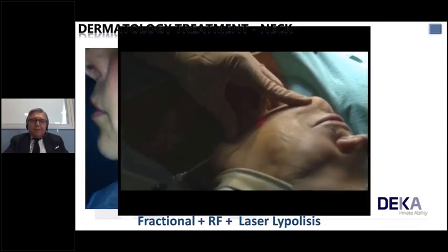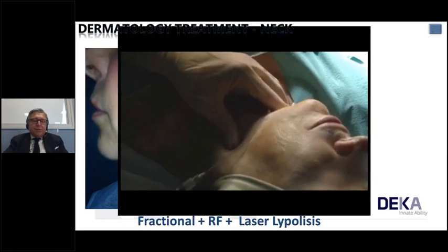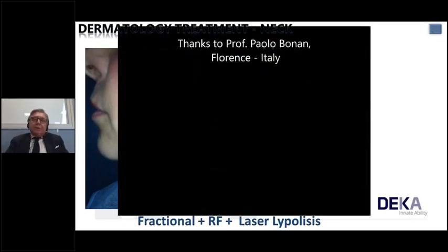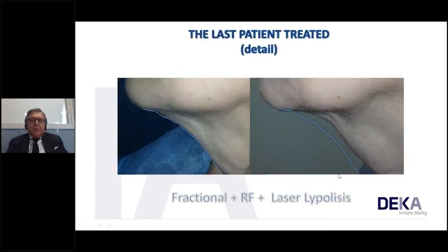Sometimes we can combine 3 modalities: fractional CO2, radio frequency simultaneously emitted with the laser, and laser lipolysis, characterized by the injection of local anesthesia and then the use of a 300 micron fiber and Nd:YAG with one of the products of DEKA, that is Smart Lipo.